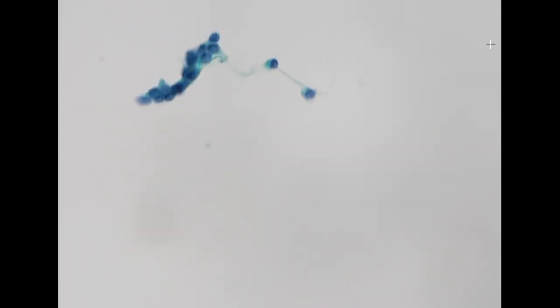It actually looks more like a very large nodule, with a very non-specific sonographic feature. Occasionally, it can also be PTC, but because the sonographic finding is not highly suggestive, I think for this specimen, we will make a diagnosis of TBS5, suspicious for papillary thyroid carcinoma.